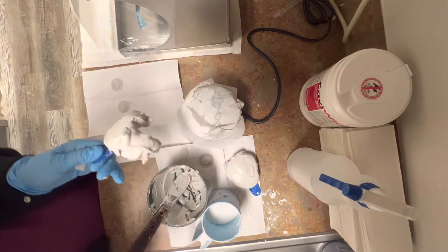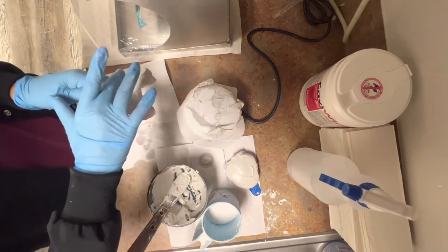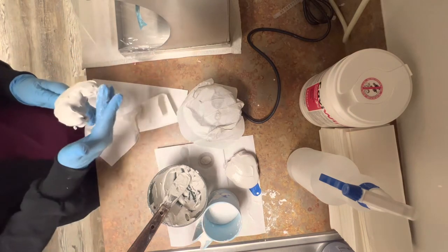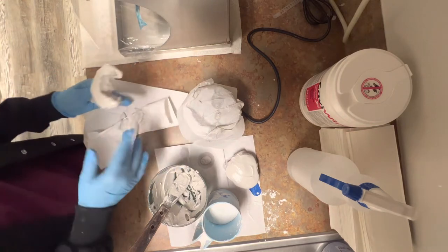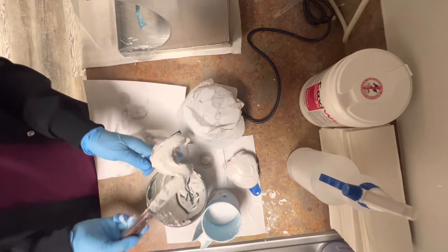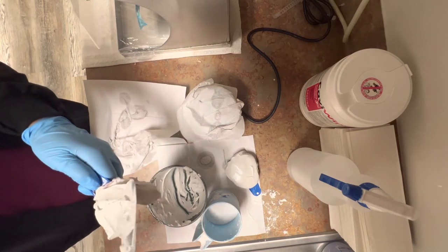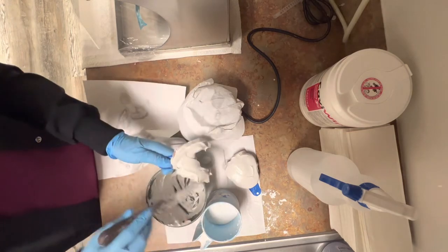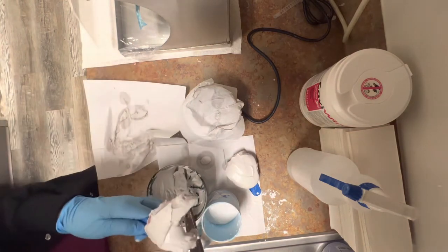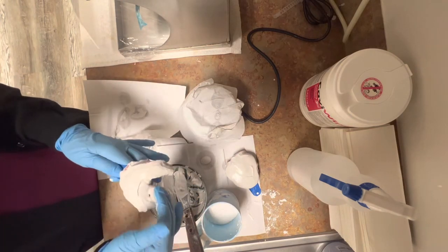I ran some water and I'm wetting my fingers so I could clean up the area where I got stone on the tray. Remember, we do not want stone on the tray because this will make your impression harder to pull apart. I'm putting more stone because it's very important that we have that nice second layer, and I'm wetting my fingers again, going all over it on top, cleaning it, making it look nice and pretty.